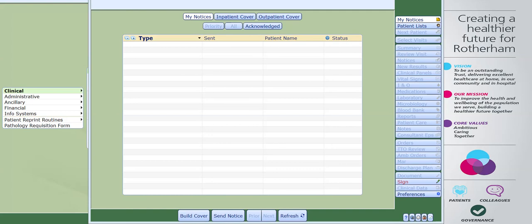So how do you view radiology results for patients under your care? All results for patients under your care will still be filed under the RA number in the report section of physician care manager within the Meditech system. However, results that are now urgent or critical you will only be able to see when you log on to Meditech in the my notices section.